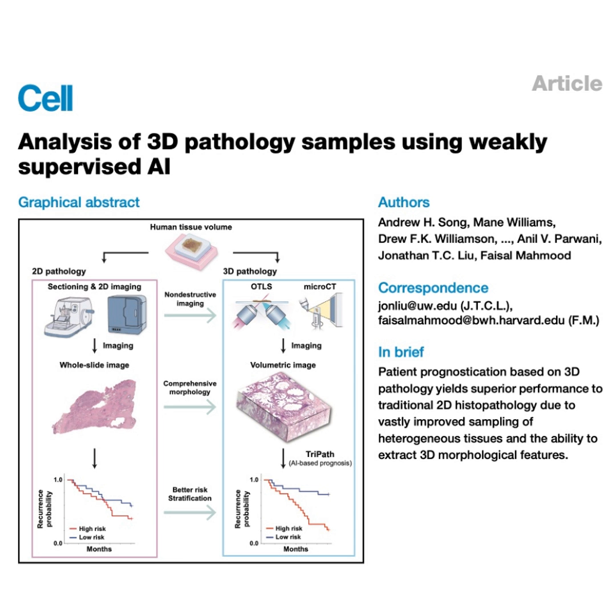That's a huge practical advantage, especially for things like prostate cancer, where decisions about active surveillance versus treatment are so critical and often rely on integrating pathology with molecular data. Keeping the tissue intact is a big deal. It really is. This non-destructive aspect, combined with the superior accuracy, could pave the way for new laboratory-developed tests, LDTs, based on computational 3D pathology. It offers a path to getting more information more accurately without consuming the sample. So this research definitely seems to push computational 3D pathology much closer to clinical reality. It addresses the why and the how. It really lays out a strong case.